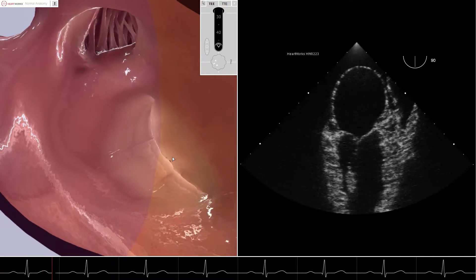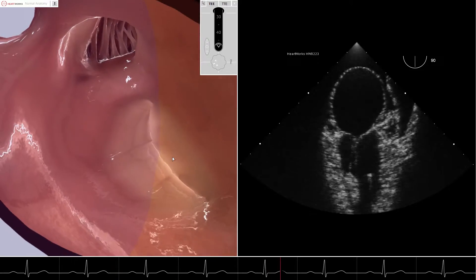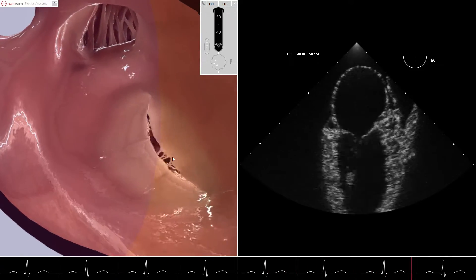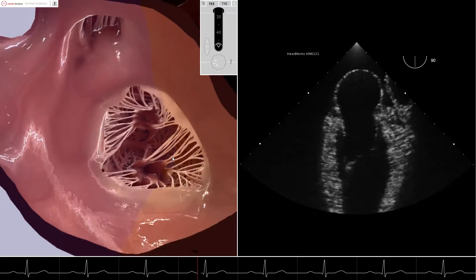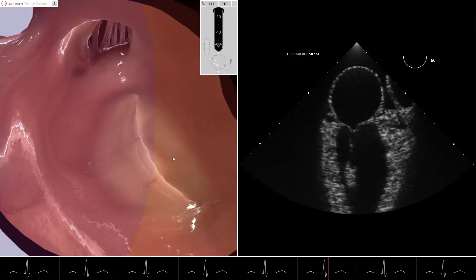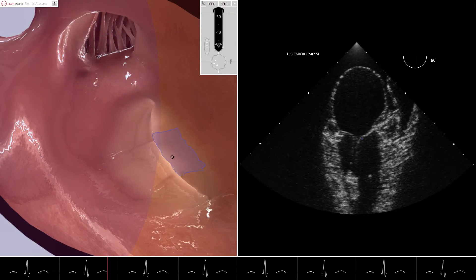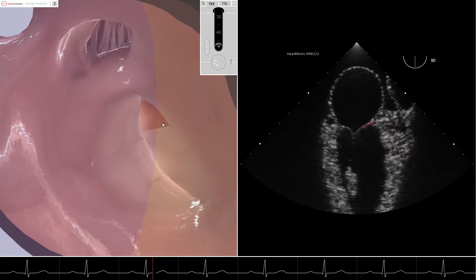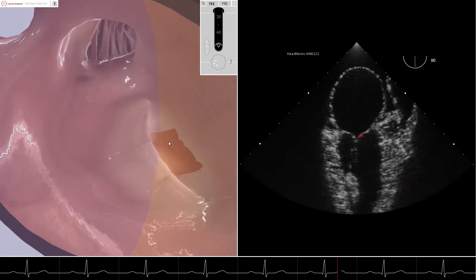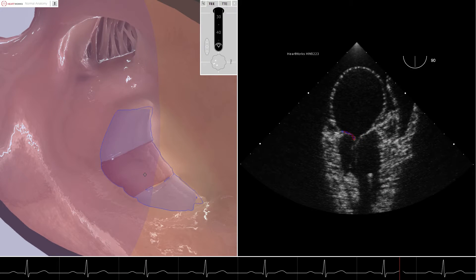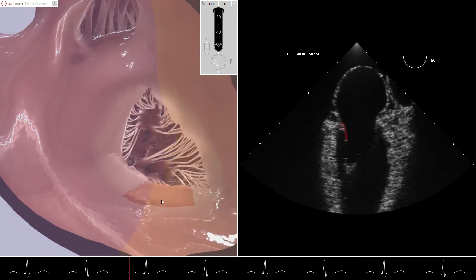In the next image, we have advanced the omniplane to 90 degrees. In this case, the cut plane transects the anterior mitral leaflet and the posterior mitral valve leaflet. The anterior mitral valve leaflet will always be associated with the anterior wall of the left ventricle. Identification of the exact scallops transected cannot be determined in the 2D view. In this case, the scallops transected are A1, part of A2, P2, and part of P3.